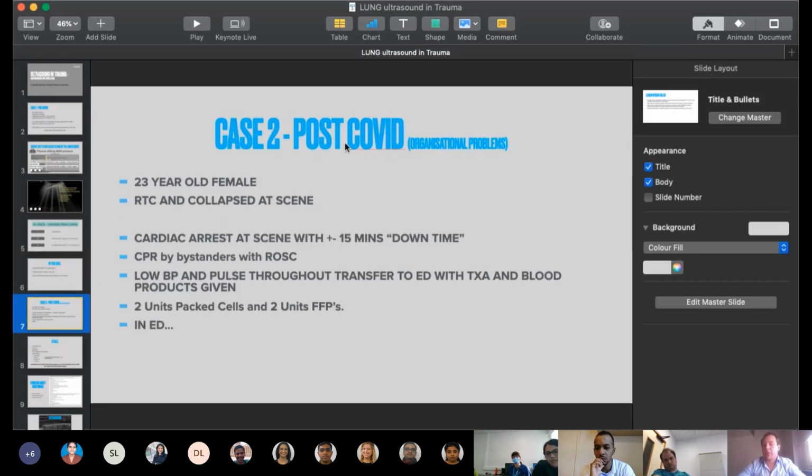And it was interesting because it's not part of the normal trauma ultrasounds. He was a unique case, and when you get the EFAST protocol, it's lung sliding, fluid in the pleural cavity, and there you go.